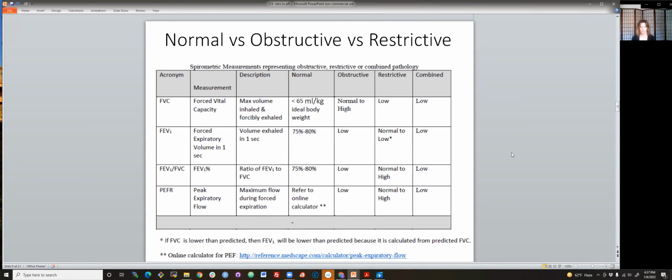Instead, we will use the FEV1 to FVC ratio. This is more predictive of an obstructive problem. So for my class, we won't use FEV1 by itself to say somebody's got an obstructive disorder, because that's a flow problem, right? We must use it in relation to the FVC.